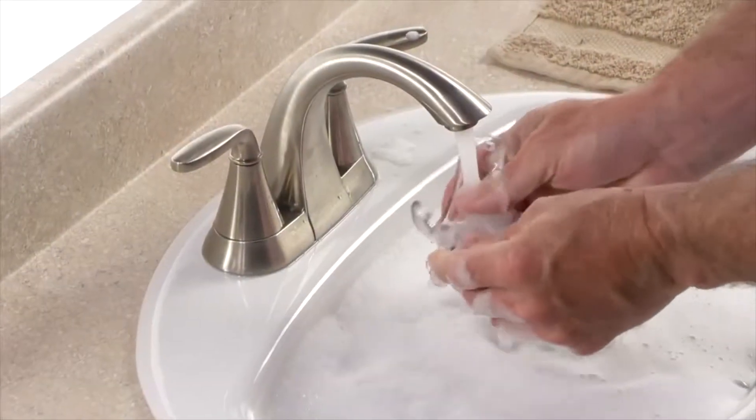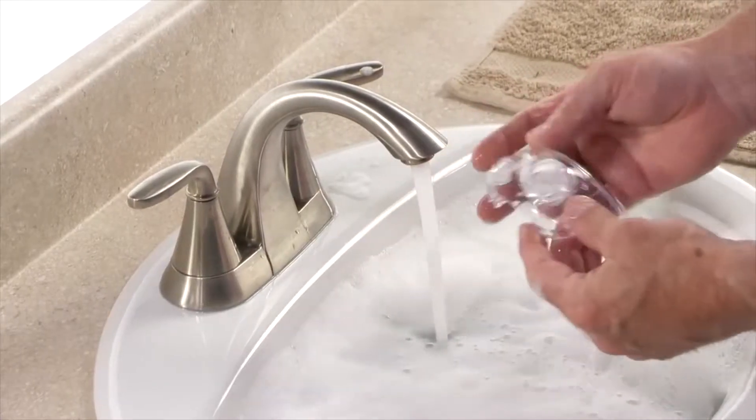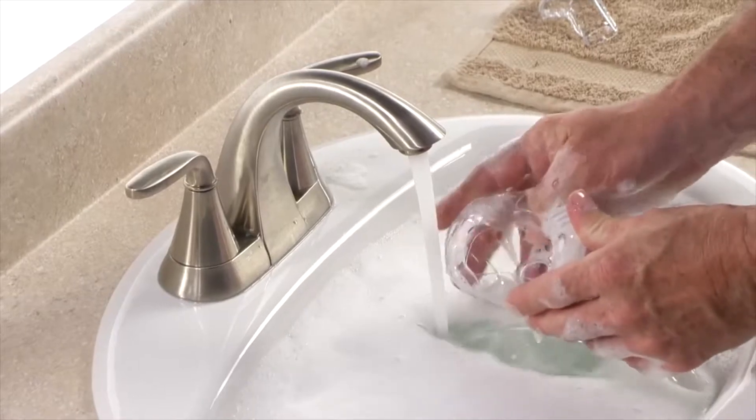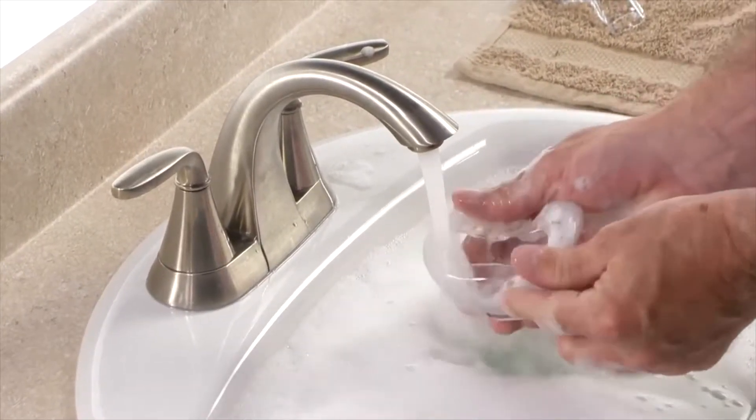Hand wash the mask frame, cushion and quick-release tubing each day in warm water with mild liquid dishwashing detergent. Do not use bleach, alcohol or cleaning solutions containing bleach, alcohol, conditioners or moisturizers to clean your mask.